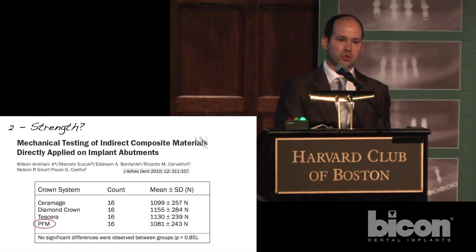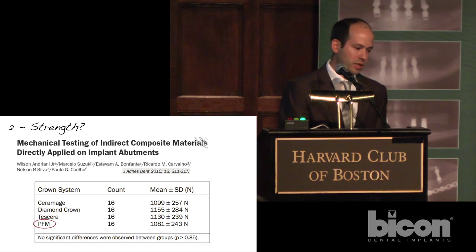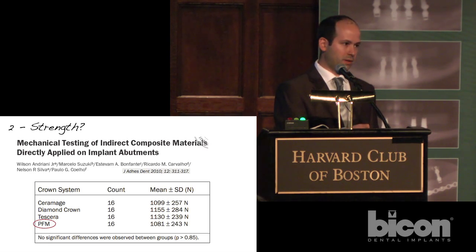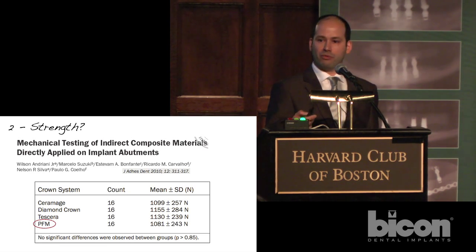But believe it or not, this was one of the most important data sets that we have ever collected. And I'll tell you why. From this study, where you see the loads to failure above 1,000 newtons, we learned that if we were to test composite materials for fatigue in regular screwed systems, the abutment systems, their screws, or even the implants would actually fail even before the composite materials.